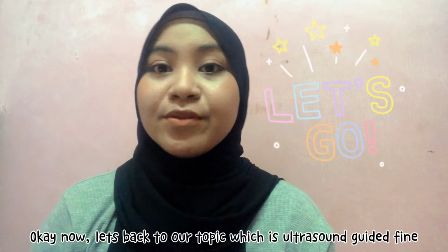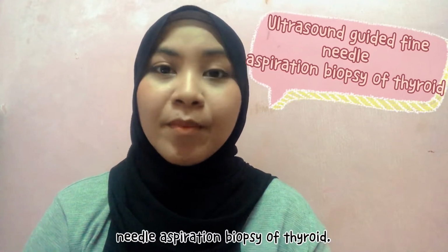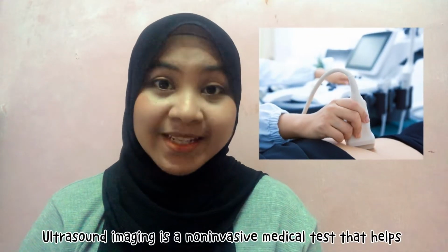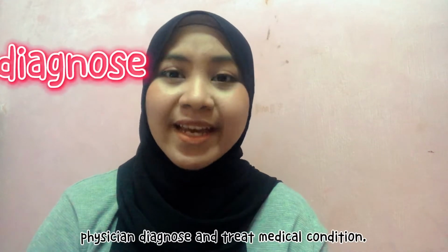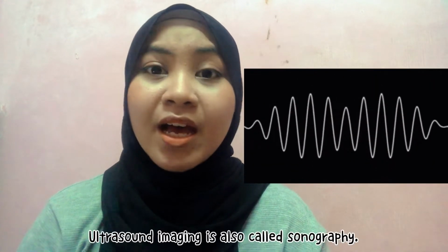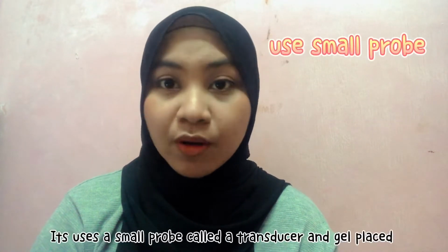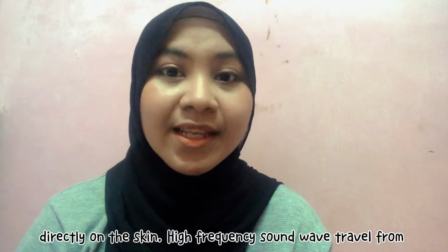Okay, now let's go back to our topic, which is ultrasound guided fine needle aspiration biopsy of the thyroid. What is ultrasound? Ultrasound imaging is a noninvasive medical test that helps physicians diagnose and treat medical conditions. It produces a picture of the inside of the body using sound waves. Ultrasound imaging is also called sonography. It uses a small probe called a transducer and gel placed directly on the skin.